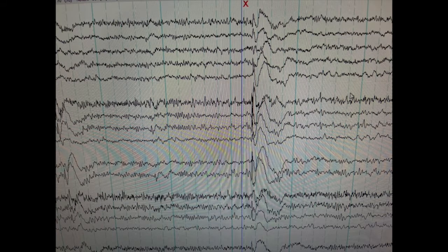In the back of my mind I'm thinking she's moving around a little bit, so this is probably muscle artifact. That's a good rule of thumb — if something is just an isolated incident and only happens one time, I'd lean more towards artifact, maybe just a muscle spike. But it happens a couple more times throughout the EEG: a sharp spike and a slow wave that follows. It was most prominent on the left central part of the brain and had a field, spreading to the other electrodes as well.